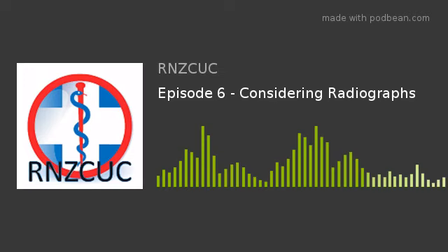Yeah. So what about clenched fist views? These are views that we're often doing when we've got concerns around particularly scapholunate ligament injuries of the wrist or any kind of carpal bone abnormalities. What's involved in the patient doing a clenched fist?